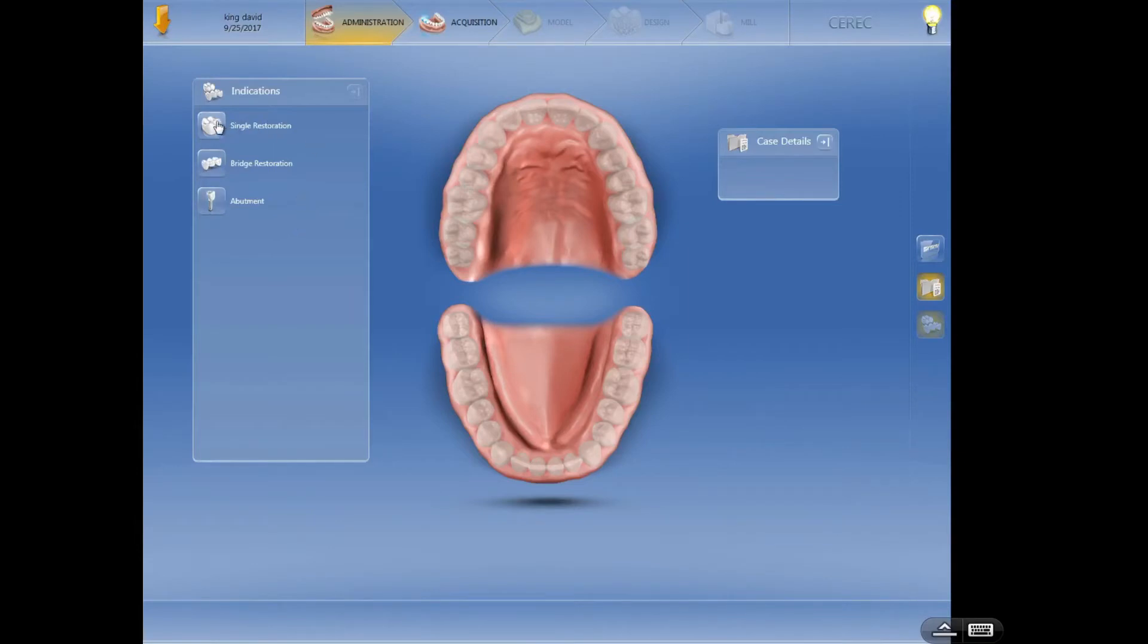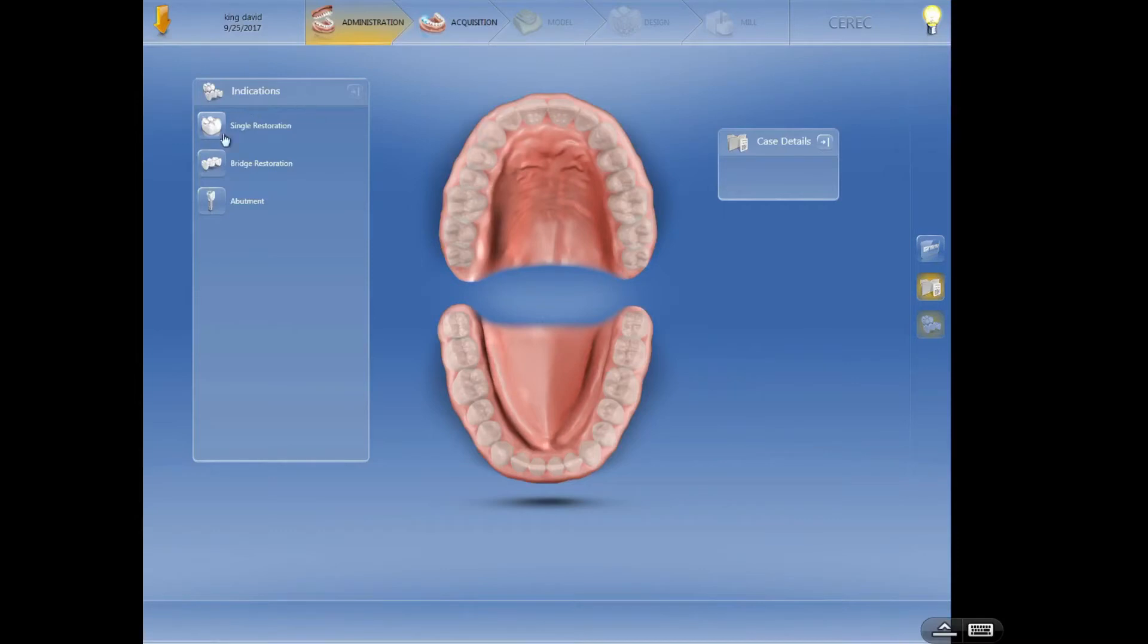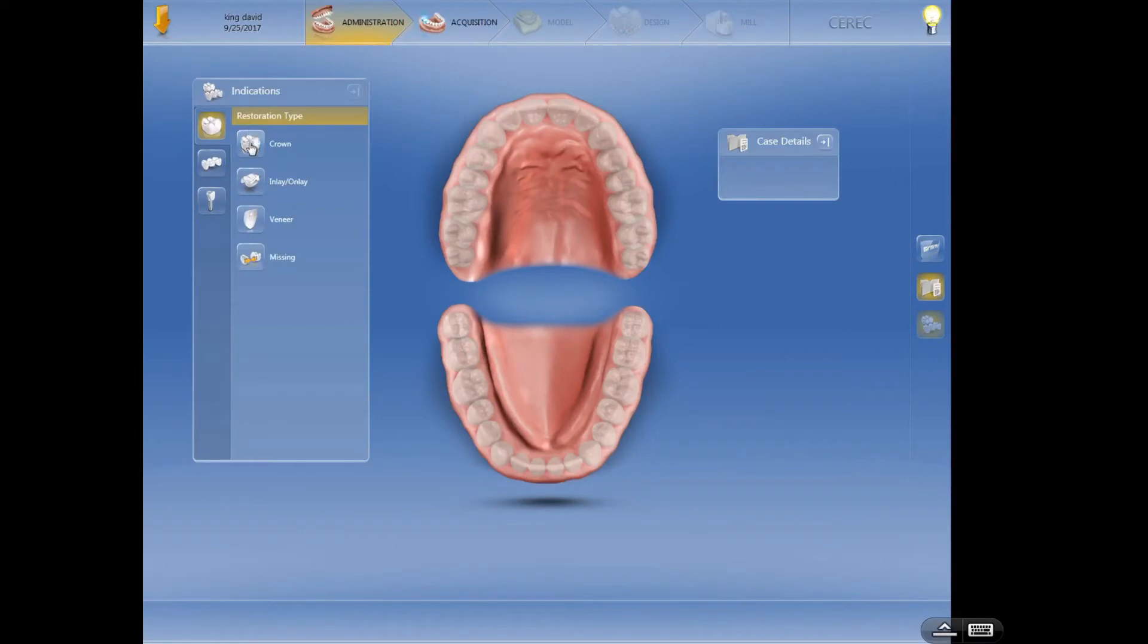Let's talk about setting up a single posterior crown or anterior crown first. You can see these teeth are all ghosted out since I haven't selected one of the indications. So I'm going to click on single crown, single restoration, and then you see we have four choices that come up.